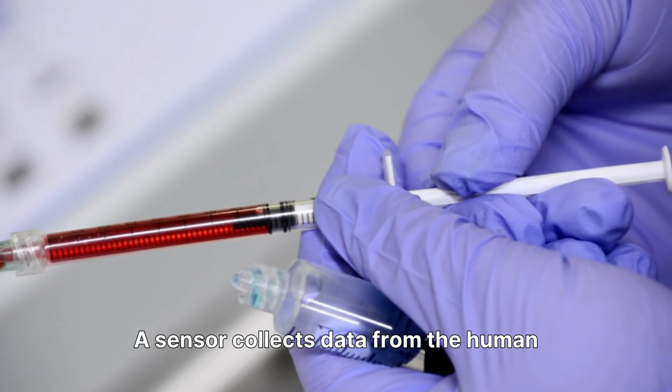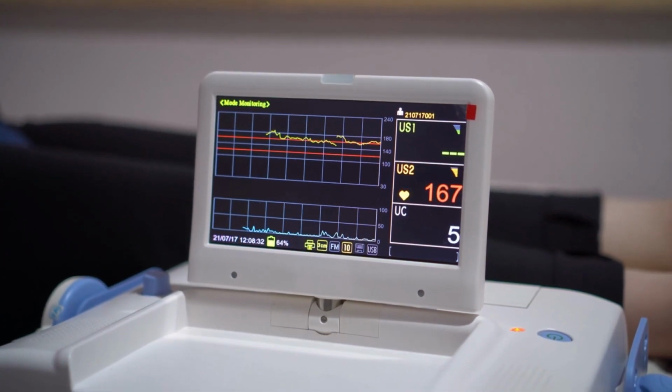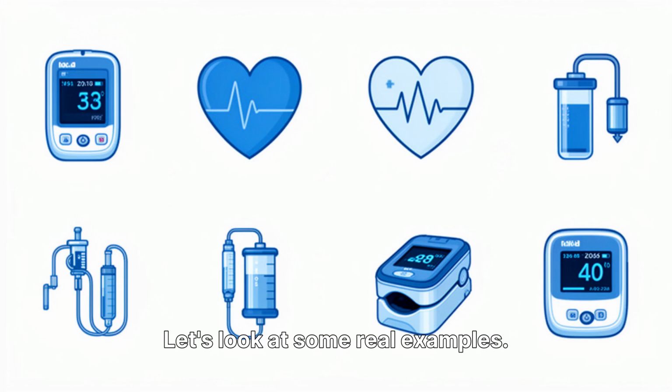A sensor collects data from the human body. A microcontroller processes that data. Then the device displays the result or sends it to another system. Let's look at some real examples.